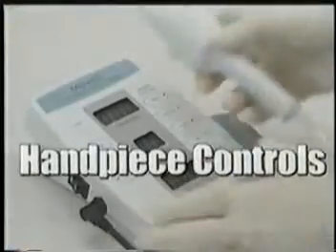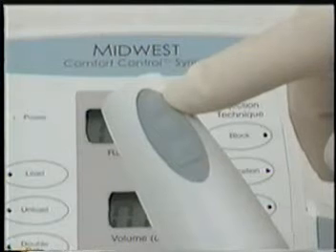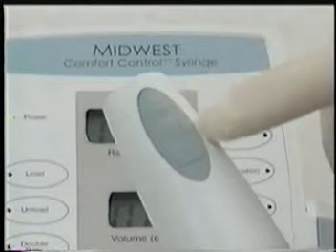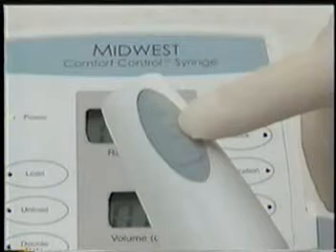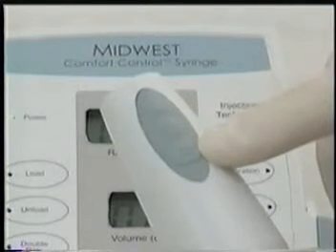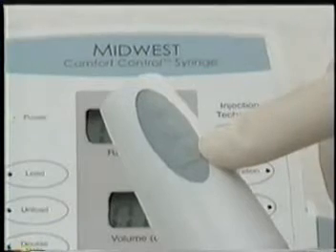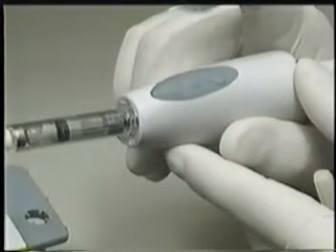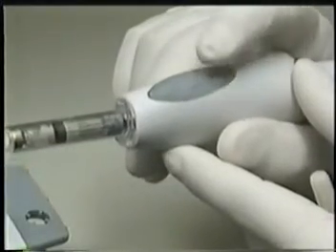Now let's review the handpiece controls. The front button with the arrow and square controls the start and stop functions by starting or stopping the plunger. The middle button activates the aspiration function by slightly retracting the plunger. The rear button initiates double rate. Pressing the double rate button will double the current injection rate at any time after the first 10 seconds. 2 beeps will sound to indicate the double rate. To return to the normal programmed rate, simply press the double rate button again.